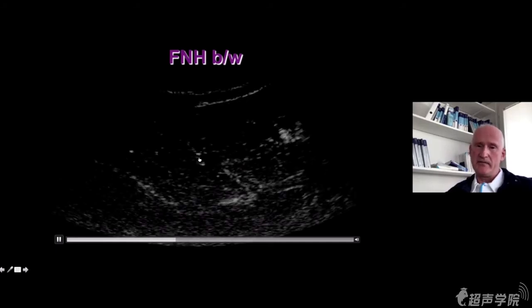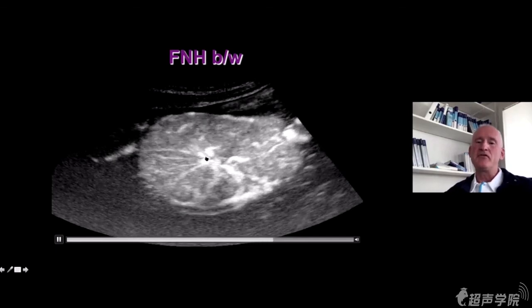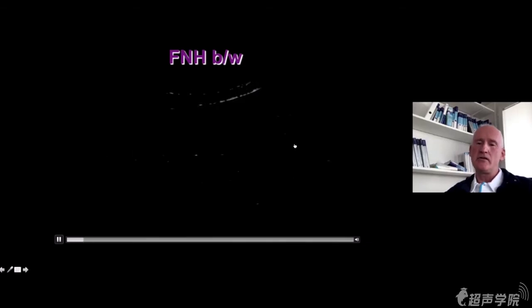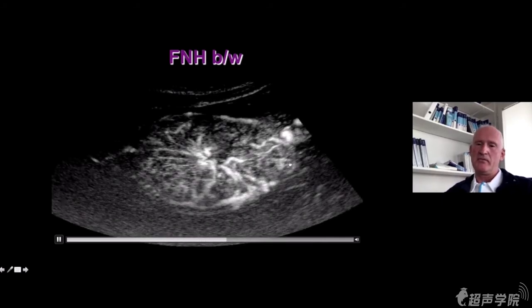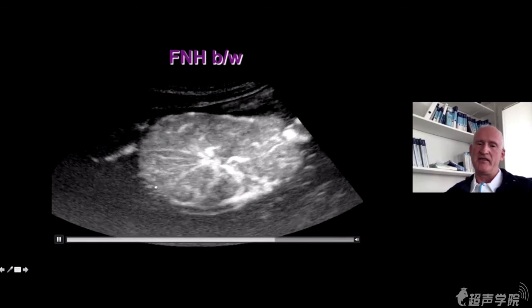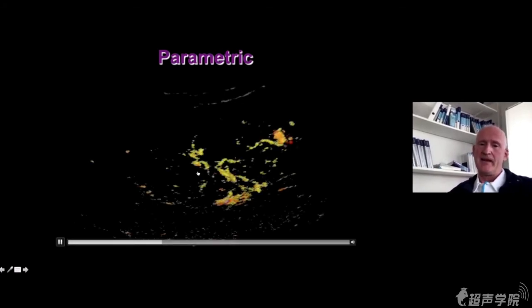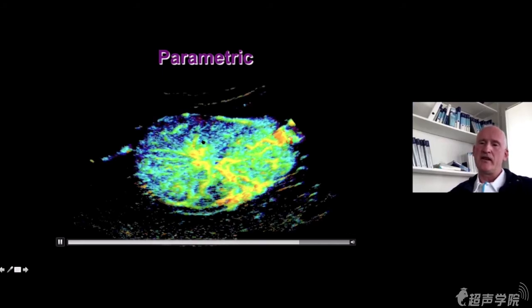The typical feature is central arterial blood supply. It might be central, it might be eccentric, it might be multilocular. So here you can see predominant central vascular blood supply, but we can see also peripherally and eccentric some vascular blood supply. And we have a fourth dimension, which is color. And the color, early yellow, later green, right now blue, gives us a fourth dimension.